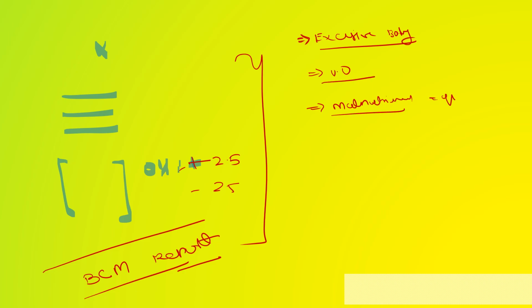Why are we doing this? If excessive water is there in the body, the patient's BP might not come under control. If less water is there in the body, the patient's urine output might not be maintained. If the patient is not adequately nourished or the patient's muscle mass is going down, his quality of life will be poor. He will have one or other non-specific complaint, or cardiac mortality increases. So that is why we are doing the BCM monitoring.